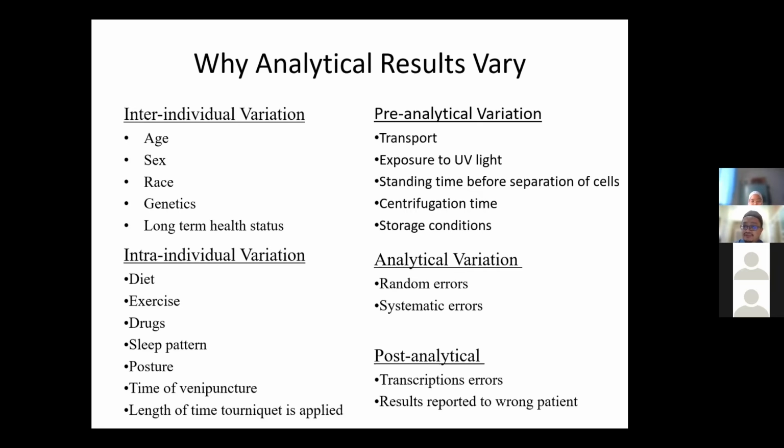I'm sure some of you are driving, and some of you are aware that sometimes your father has to send the car for service. Kan? Ini sebab ni lah, because all machines need to be recalibrated, sort of serviced. So we need to change parts, or we need to recalibrate something, so that they become accurate and will not produce errors or any unwanted effects.